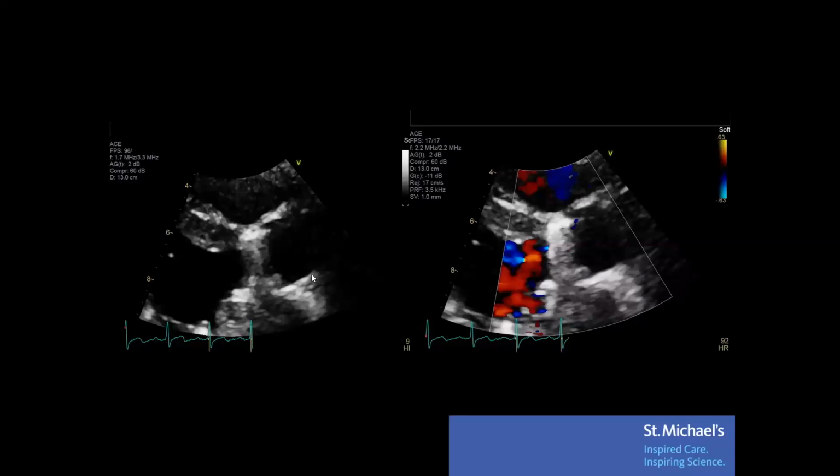So like reset it each time. One of the interesting aspects is actually there are more and more things to be measured. But the help is coming because the automated measurements are coming everywhere, including all the on-cart systems. So all the new echo machines that you buy actually have online automated measurements, and also offline measurements as well.